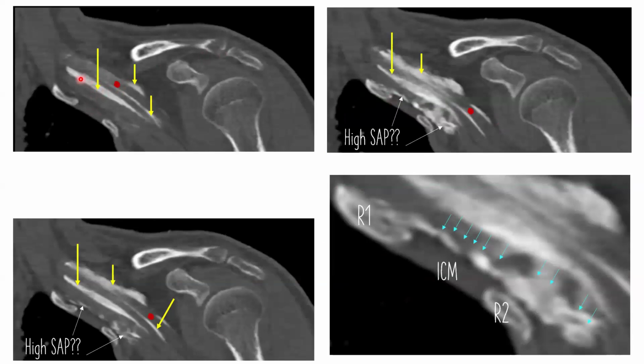This is one cord, that's the artery. So the red one is the artery. You can see the white is the contrast which is going around the artery. The cords are on the brachial plexus. This is again the contrast, thick one going around the artery. So that's the brachial plexus. Again, the same here, and this would be the same here.